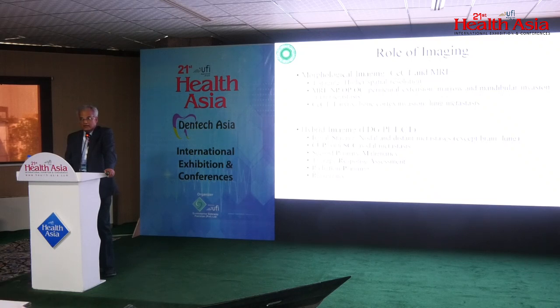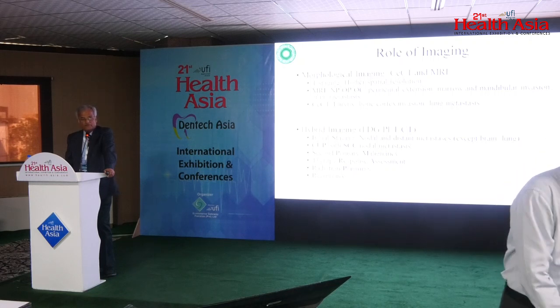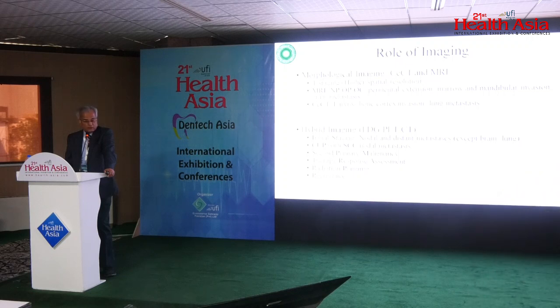While contrast-enhanced CT plays an important role in T-staging of laryngeal cancers, for bone cortical invasion, and in small lung lesions which are less than 1 centimeter, because of the partial volume effect, FDG PET-CT has limited sensitivity to detect. The FDG PET-CT based hybrid imaging plays an important role also in initial staging, but primarily in nodal and distant metastasis except brain and lung.